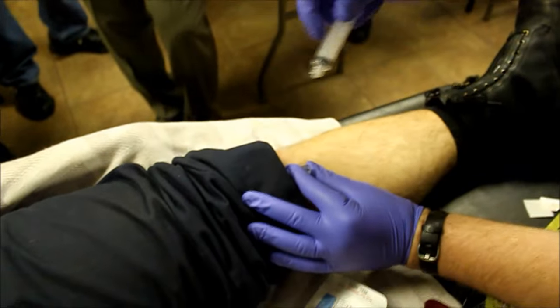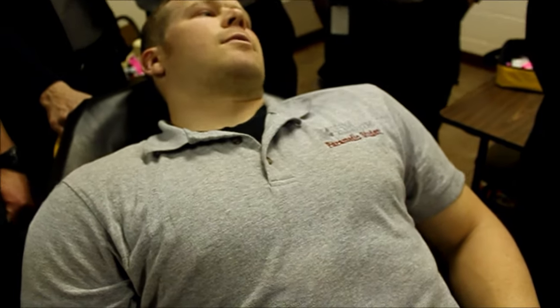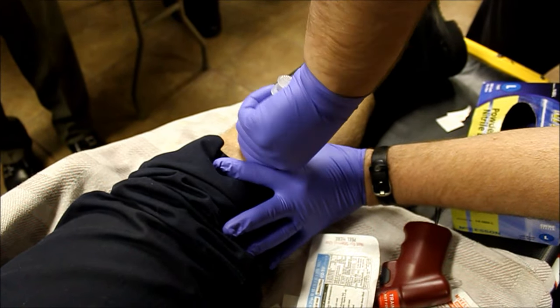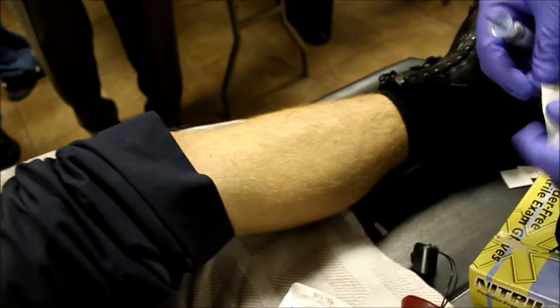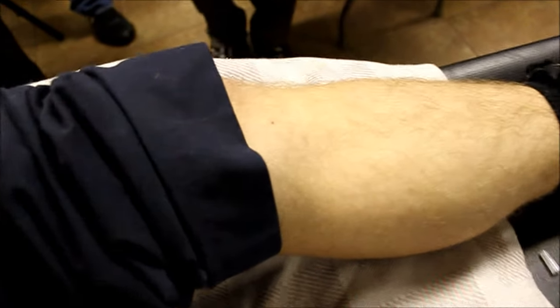So insertion pain was what, from 0 to 10? A 3? 3. 4. Turn clockwise and pull straight back with some force. Just pull straight back. Keep turning and pull back. Keep going — see, it's harder than the humerus. You know why? It's a weight-bearing bone. The cortex is thicker. Did it hurt pulling it out? Is it like a pulling sensation? Less than the insertion pain usually.